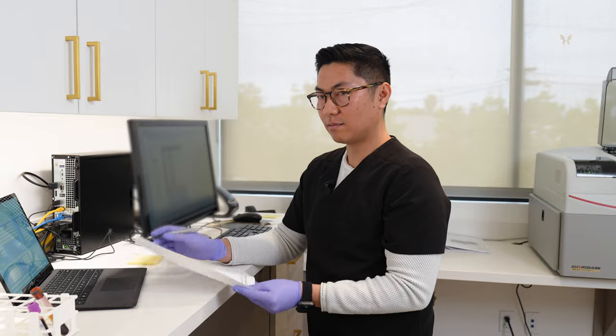We have the results right here. So you saw me take some blood — we ran one test tube through the Sysmex for the CBC, and another test tube through the Alpha Wasserman for the CMP. We looked at the results and everything was normal. Luckily, this patient was healthy, so they get to go in for surgery. This is why it's so important that we run labs in office — we have the results right away, let the surgeon see, and it's just an extra layer of protection for the patients and the surgeons.